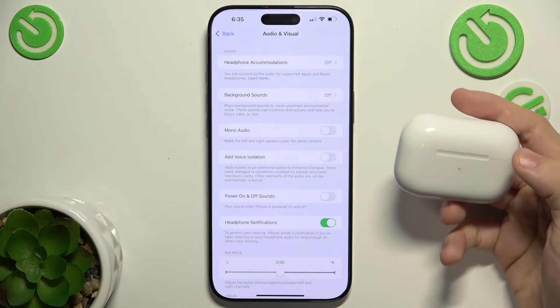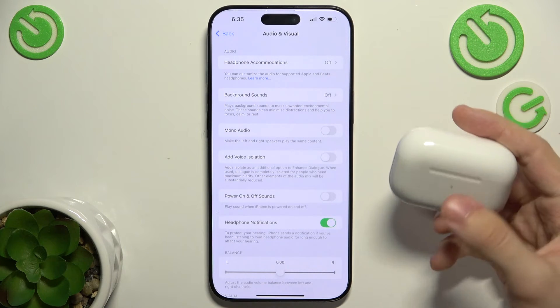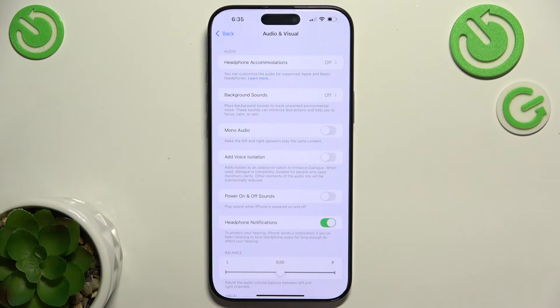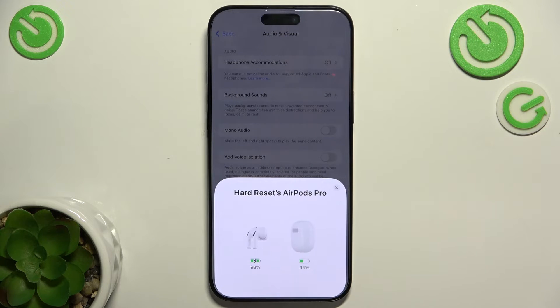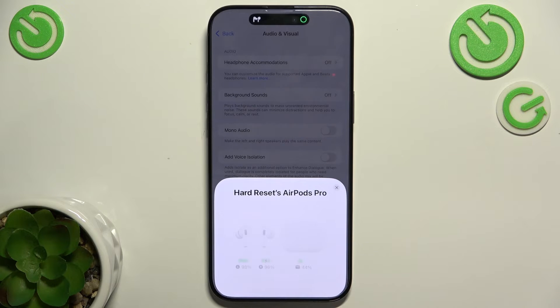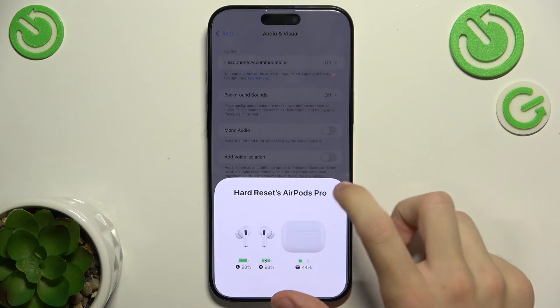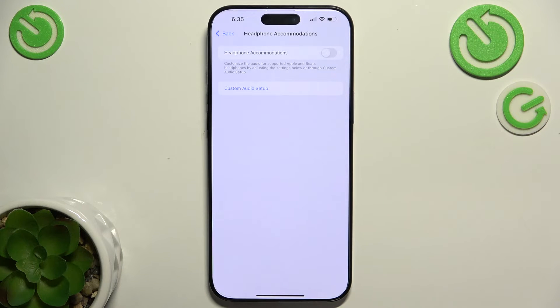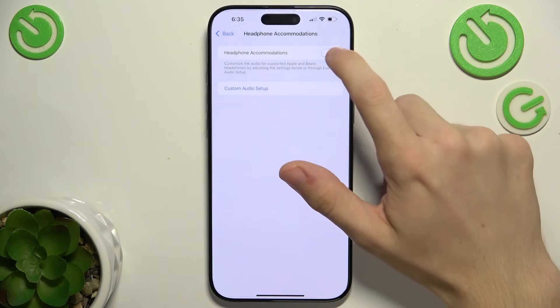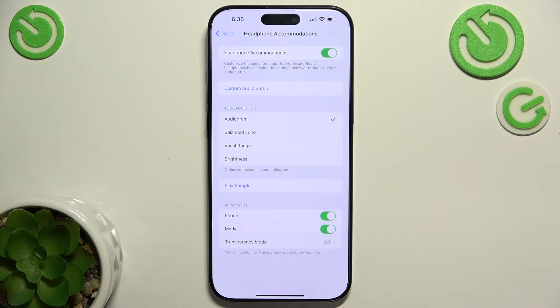I have AirPods Pro 2nd Gen. You can connect them to your iPhone and use Headphone Accommodations. I'm going to connect my AirPods and put them in my ears. And then when I go to Headphone Accommodations, I can enable them.